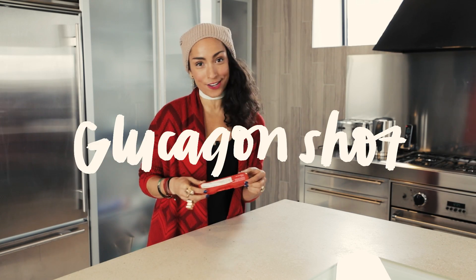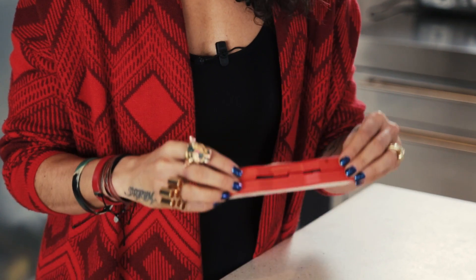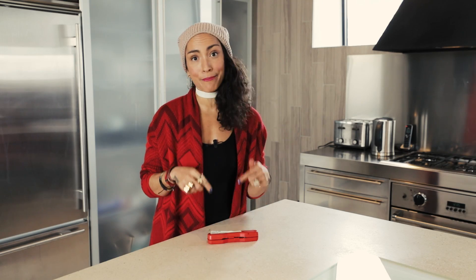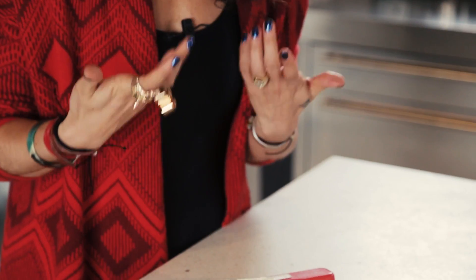Alright guys, we're going to go through a glucagon shot. This is your emergency sugar when you have an extreme low, and this is an important video to share with loved ones, co-workers, anyone you're really spending time with, because they might have to administer this if you're too low to do it yourself.